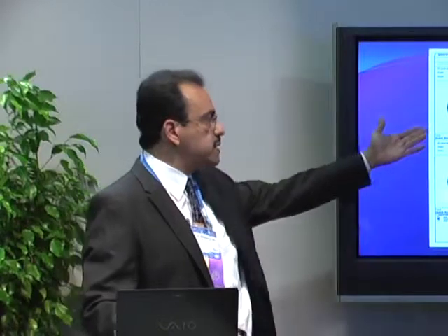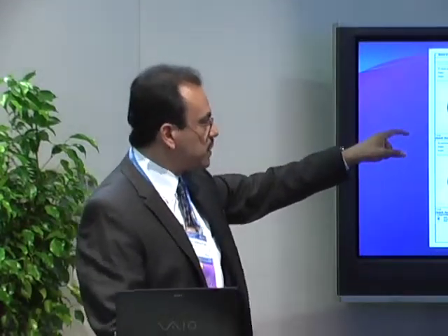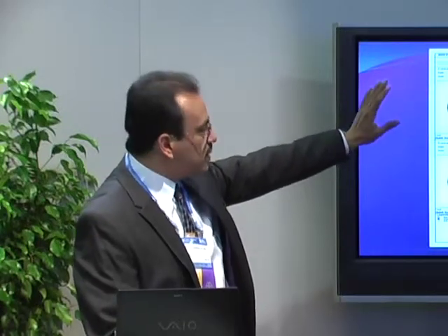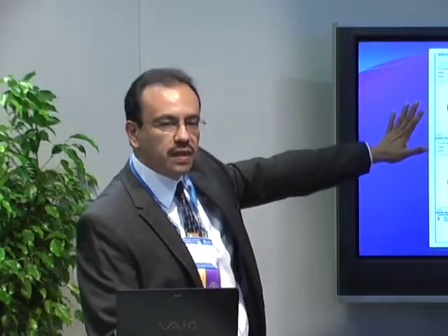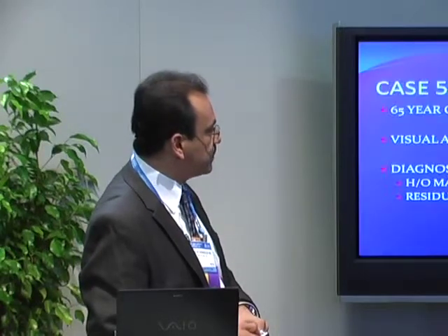What I did with this patient, I sent her home with an Amsler grid. Obviously told her to make sure she takes care of her blood sugar. She doesn't have the same problem here with treating her diabetic retinopathy. But in the left eye where she's got that obvious macular traction, we're monitoring her at home with the Amsler, and then she's to come back intermittently for evaluation with the microperimetry unit.